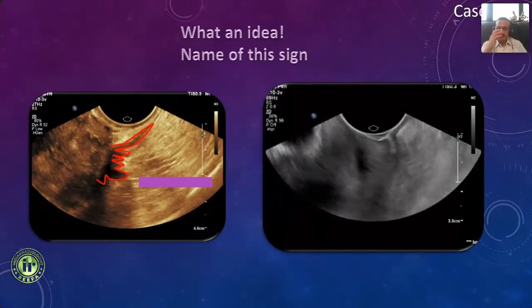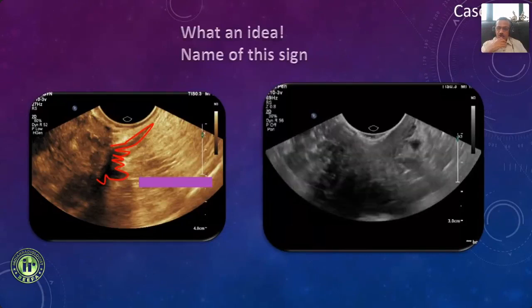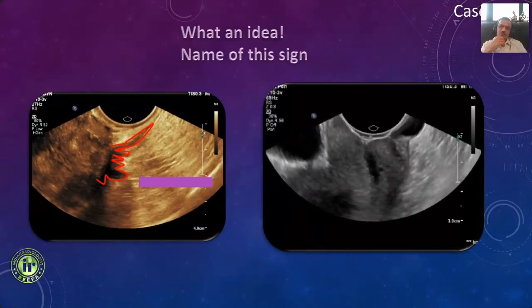What we are doing here is a dynamic scan, which all of us should be doing for this particular entity.